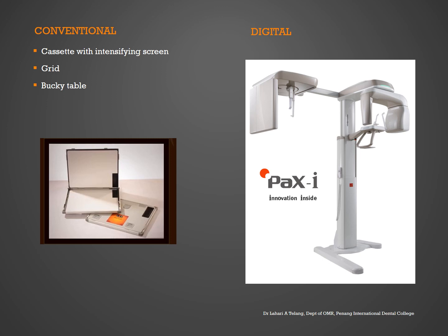So there are guide planes or beams which help to stabilize the patient, including the forehead and the external auditory meatus, so that the patient can be stable within the machine while the X-rays are emitted from the same X-ray source. The image receptor would be the sensor, which is located within the X-ray machine itself.